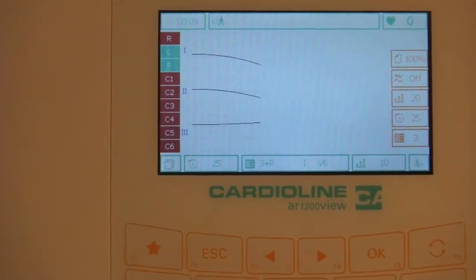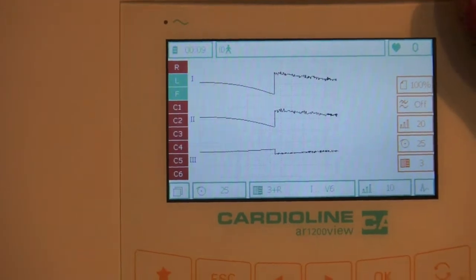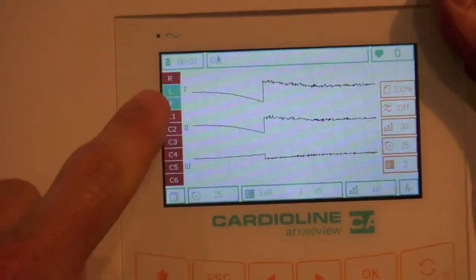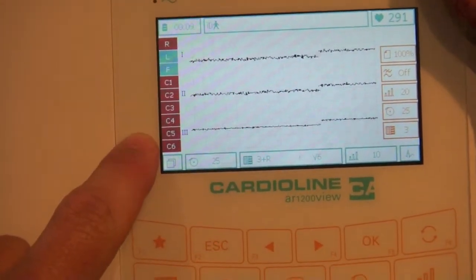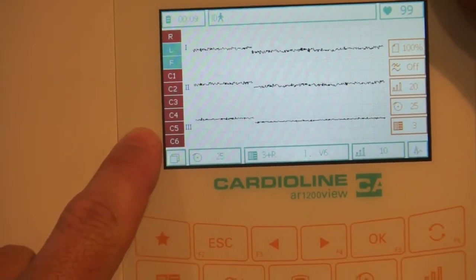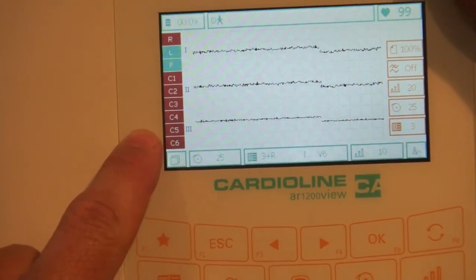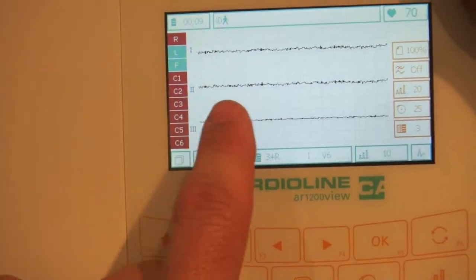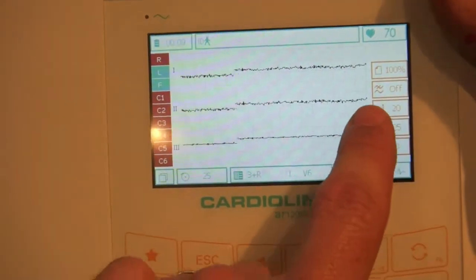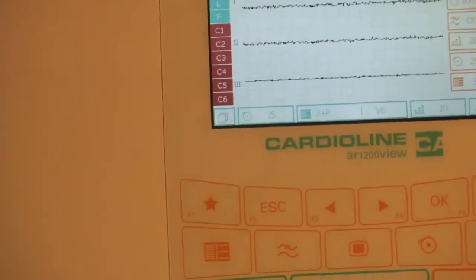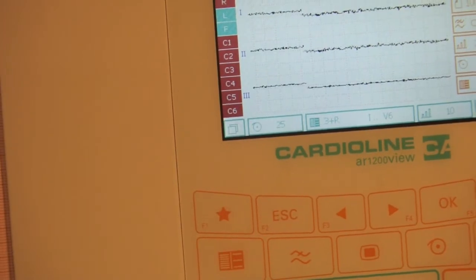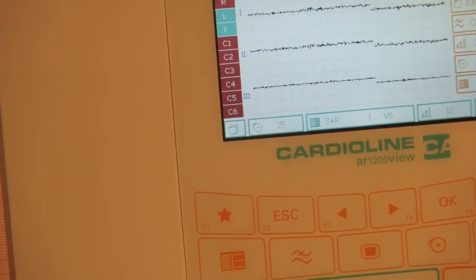It will give you a lead on, lead off indicator for all of your leads. It does provide you a three channel preview screen. You can scroll through those leads as you wish.